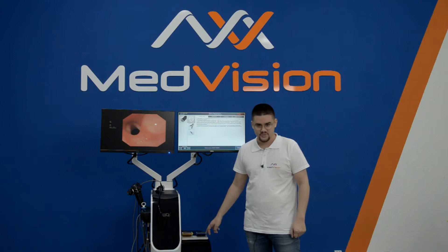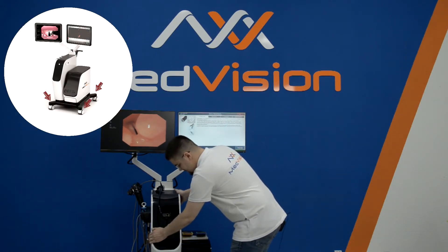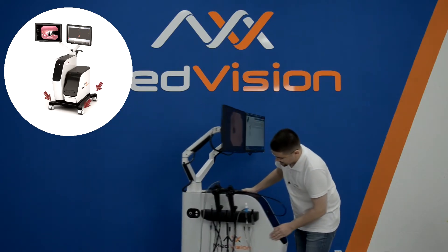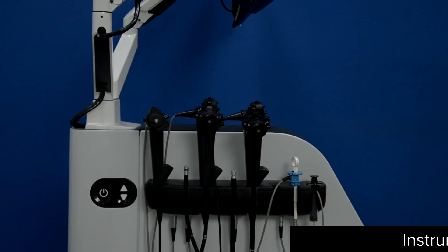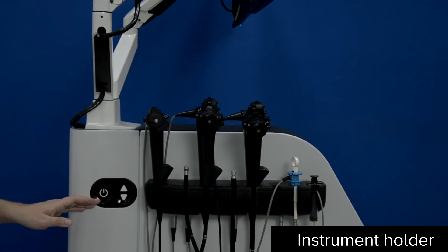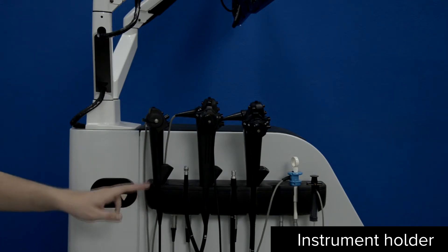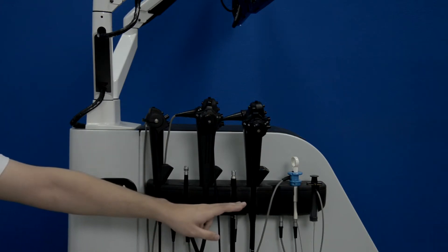Let's have a closer look at the instrument cluster on the side of the simulator. Here we have our on/off switch, height adjustment buttons, and a holder for our instruments. We have the bronchoscope, gastroscope, and colonoscope.